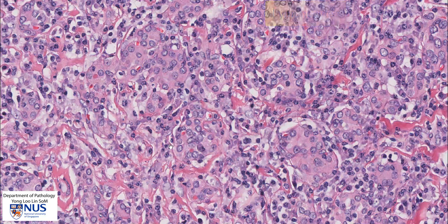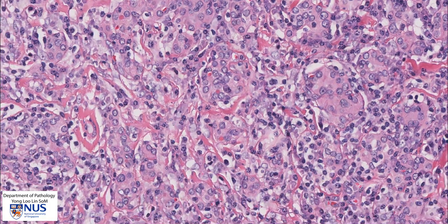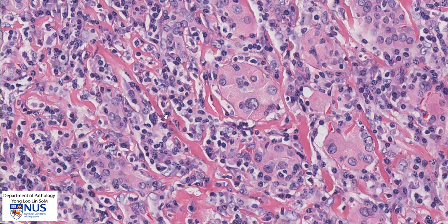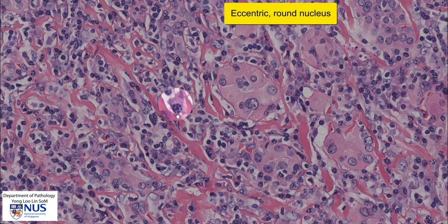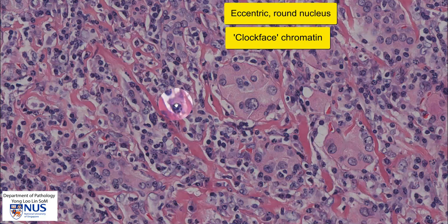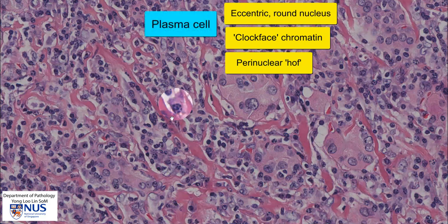Among the lymphocytes, we also see other cell types. For example, over here we can see a cell that is larger than a lymphocyte. This cell has a very eccentric, rather round nucleus, and the nuclear chromatin has a very coarse clock-face kind of arrangement — it is clumped towards the periphery of the nucleus or towards the nuclear membrane. Beside the nucleus is a slightly pinker, paler area known as a perinuclear hoff, and more peripherally in the cytoplasm there is a bluish hue. This is the classical appearance of a plasma cell.